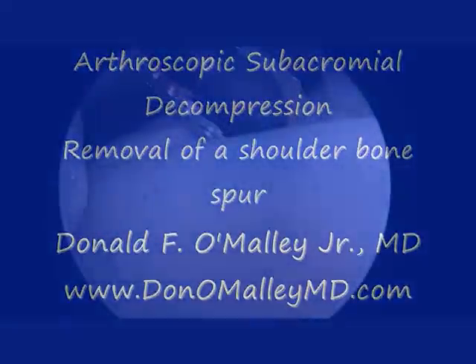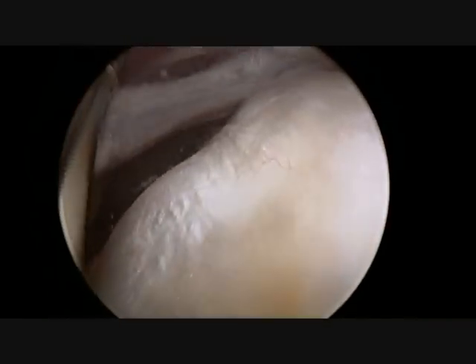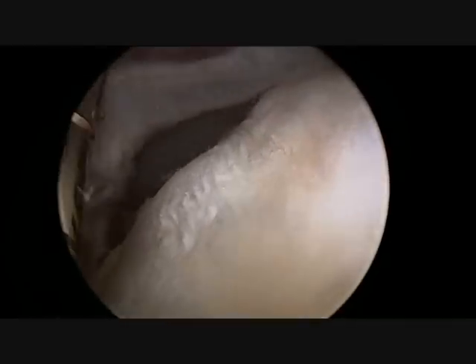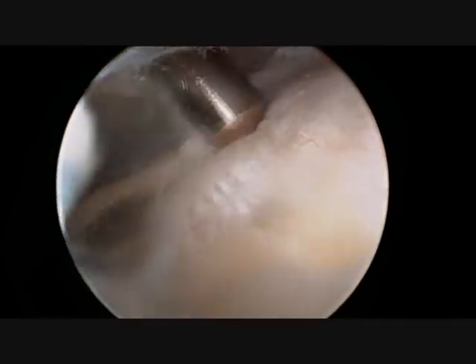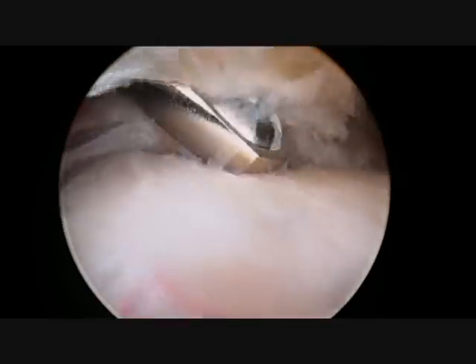Welcome to my instructional video of an arthroscopic subacromial decompression of the shoulder. A subacromial decompression is done to remove a large bone spur present on the undersurface of the acromium, a portion of the shoulder blade. This is done in order to eliminate pain in the shoulder from bursitis and or tendonitis of the rotator cuff.